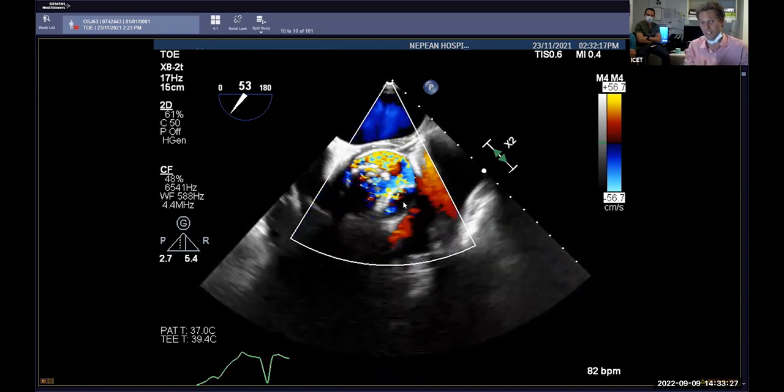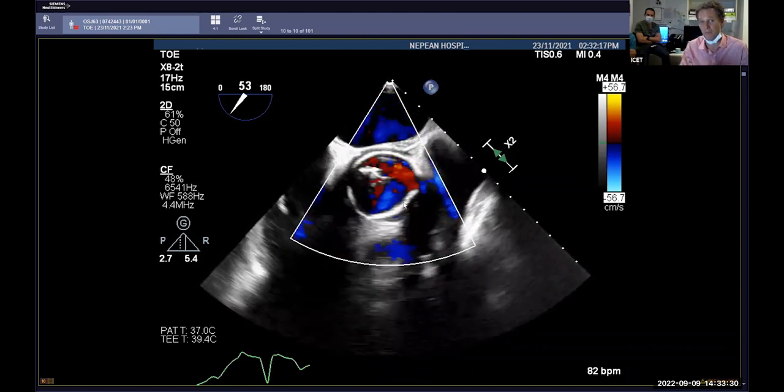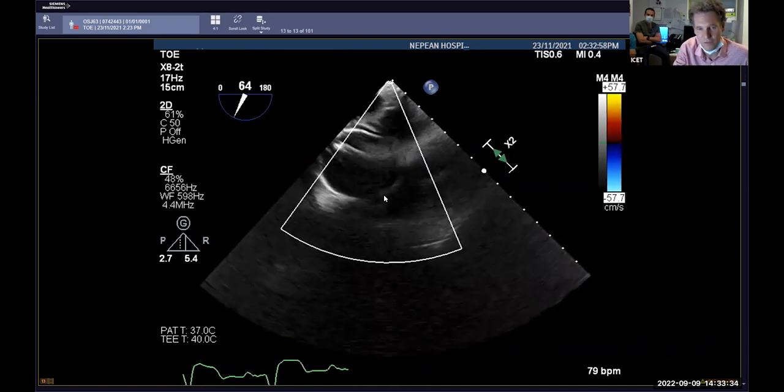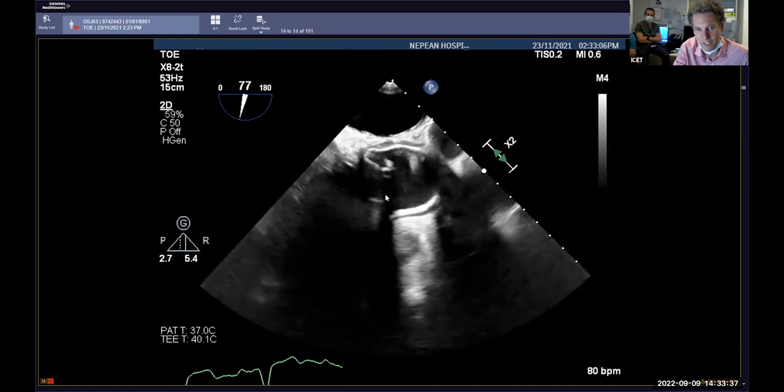I think it's suggesting that we've got the Bental's, which, if we haven't got any horrible regurgitation, it's absolutely coming, and we're going to get some form. It's a dehisced Bental's graft. Just going to see if we can find some valvular assessment with the color Doppler.